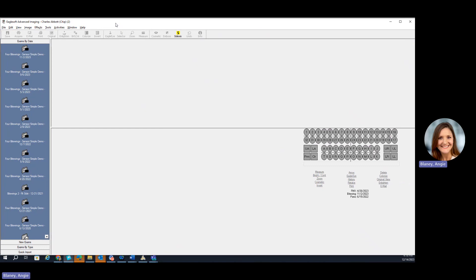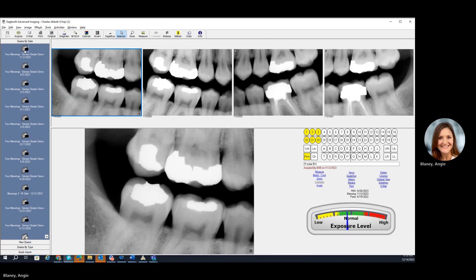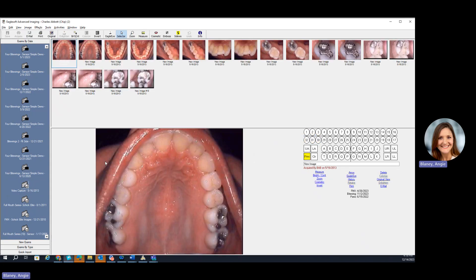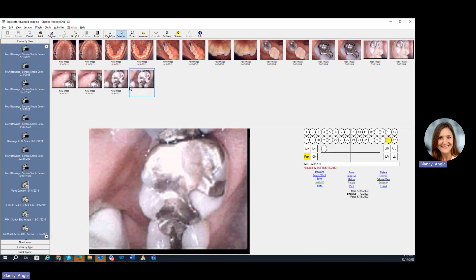This is the imaging module here. All of your previously exposed images are going to be on the left-hand side — whether it's bite wings, full mouth series, pano, or intraoral video camera pictures — are going to be able to be captured within EagleSoft too.